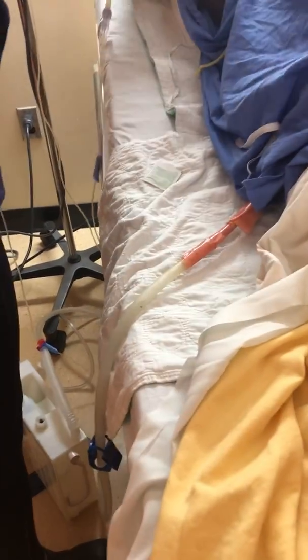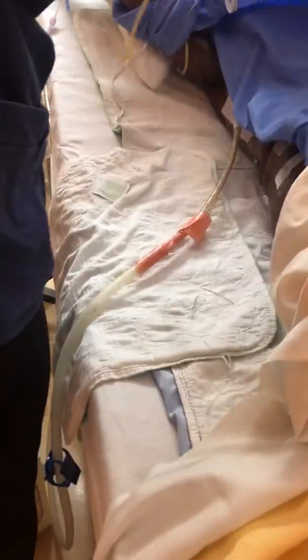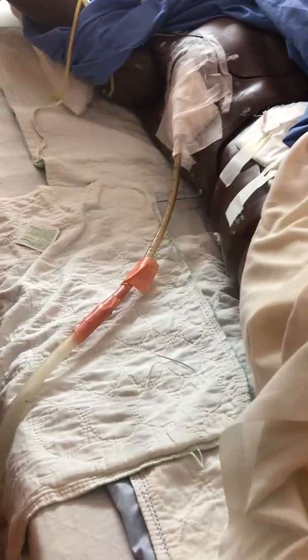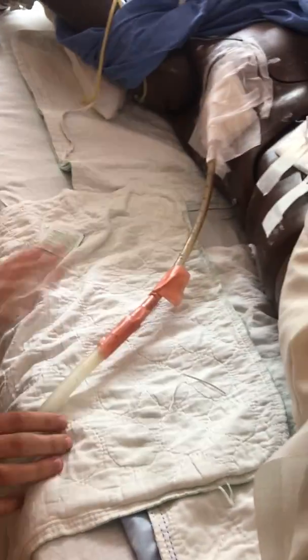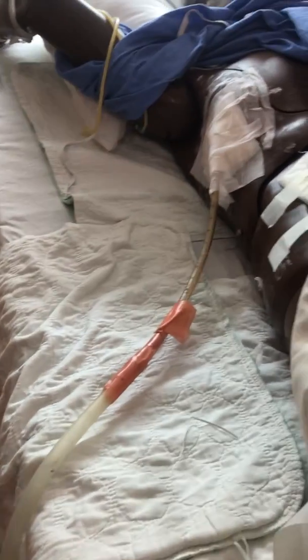Get that out of the way, good. I'm just going to keep him covered as much as I can. Expose the site, thank you. Okay, so we followed the line to him, nothing is kinked. The pleurovac is below the drainage site, so everything can drain smoothly, so that's good.